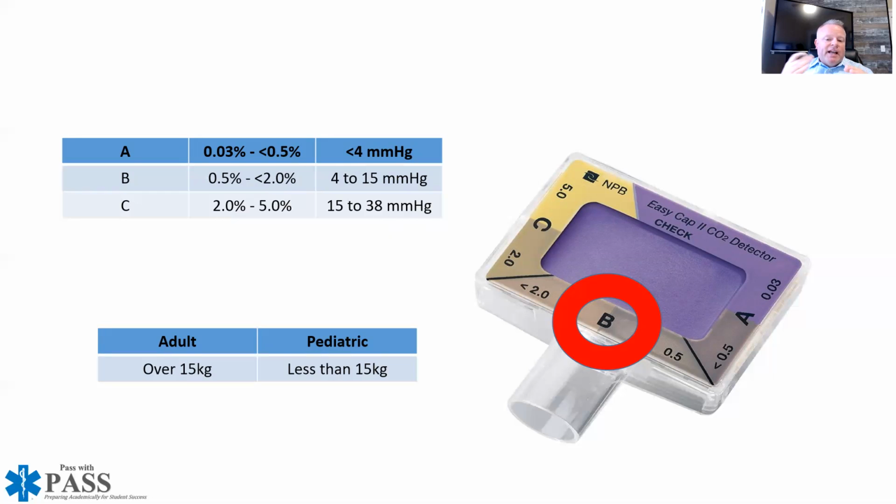When the patient exhales, that breath comes back, and we know that they are exhaling carbon dioxide. Well, because the cap is so big in proportion to what their tidal volume is, they're not able to completely clear that breath. So as I follow up and squeeze that bag a second time, I'm actually forcing that carbon dioxide back down into your patient. So in pediatrics, if you do not have the right size cap, I would rather you listen to lung sounds, look for condensation in the tube, direct visualization through the vocal cords. Always go back to those backup mechanisms.